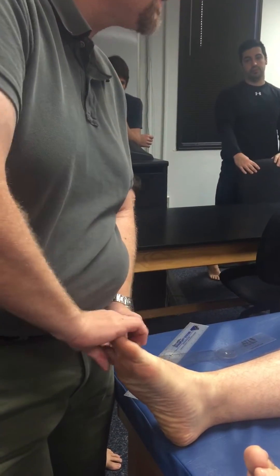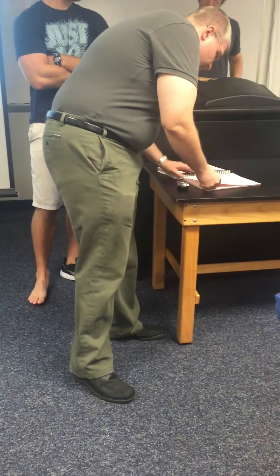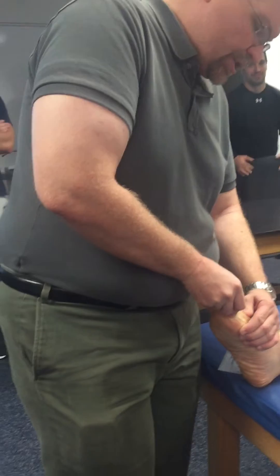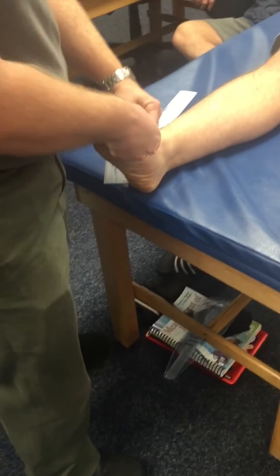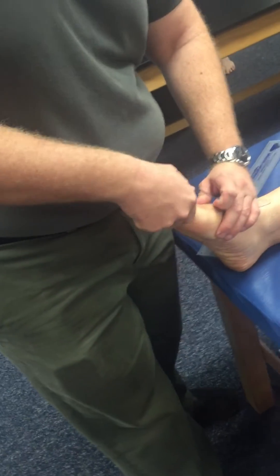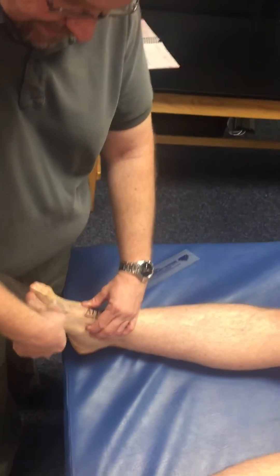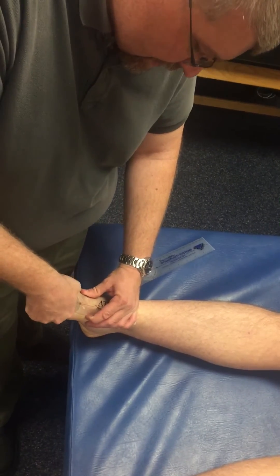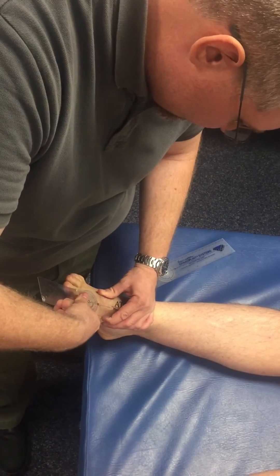You can do flexion and extension for all of the joints. For abduction of the toe, the axis is right over the MTP joint. The proximal stationary arm goes over the first metatarsal, and the distal arm follows the midline of the proximal phalanx. For abduction and adduction, the arbitrary zero line is between the metatarsal and the toe — as long as he crosses that imaginary zero line, my number is zero to whatever I get.